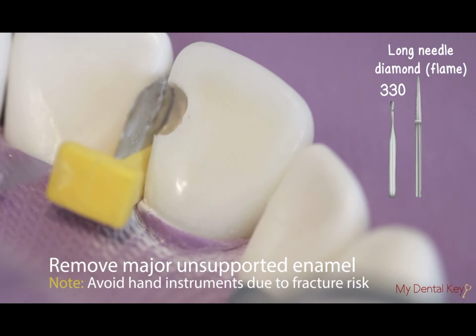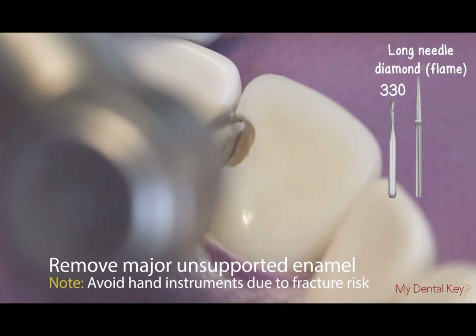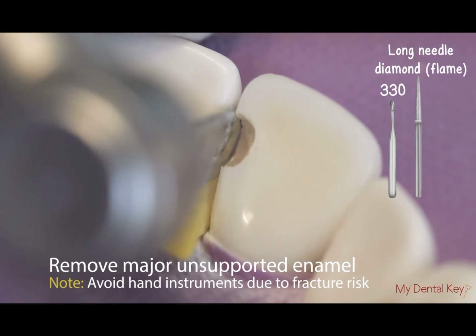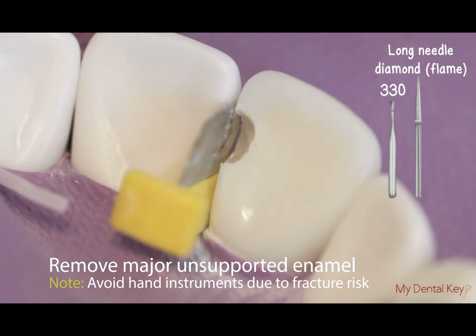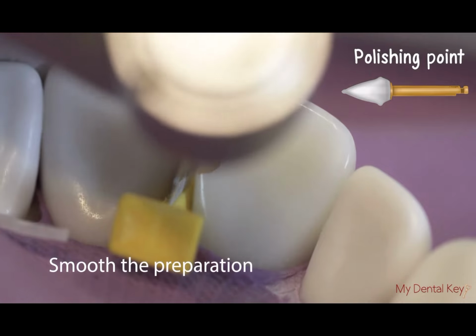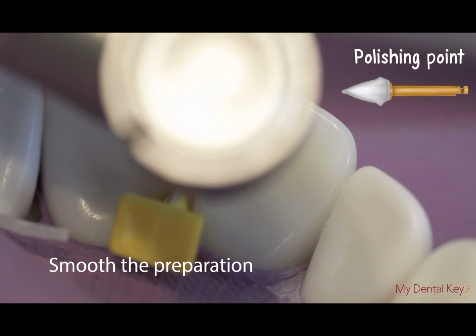For tiny areas that have unsupported enamel, you can use the flame diamond burr. Make sure you have protection so you do not cause iatrogenic damage to adjacent and sound tooth structures. If you do scratch or cause iatrogenic damage, you may polish it with a slow speed polishing point.